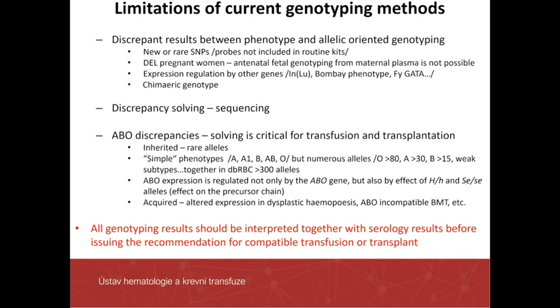In such situations, all genotyping results should be interpreted together with serology results before issuing the recommendation for compatible transfusion or transplant.